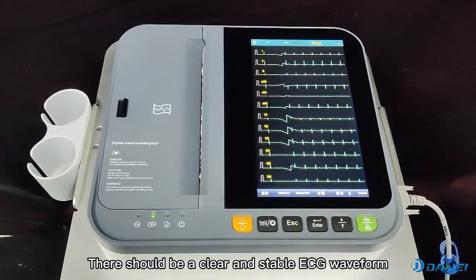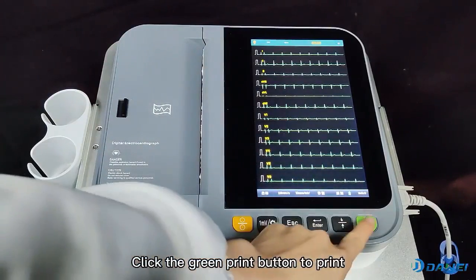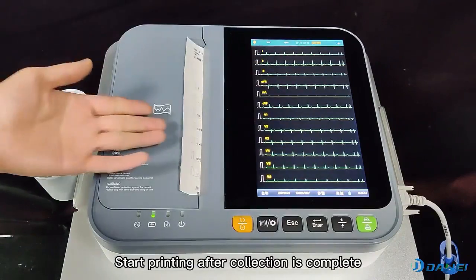There should be a clear and stable ECG waveform after the lead connection is completed. Click the green print button to print. Acquisition time is shown at the top of the screen. Start printing after connection is complete.